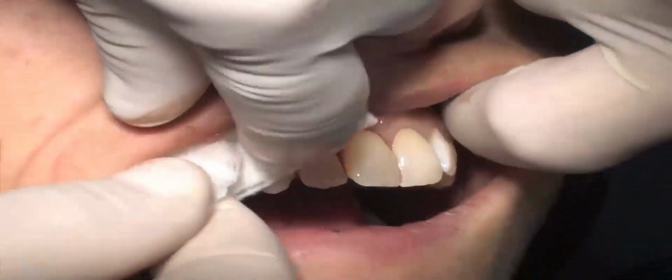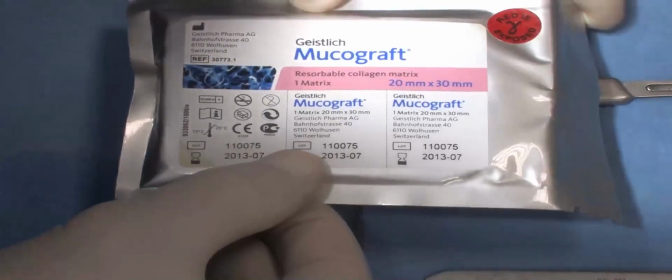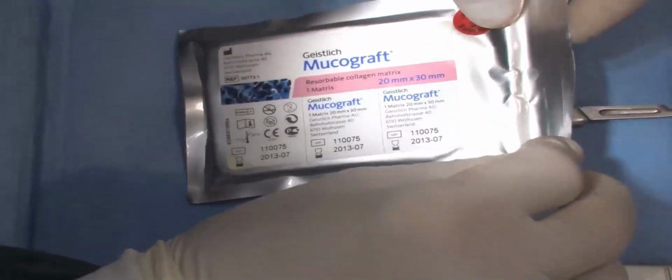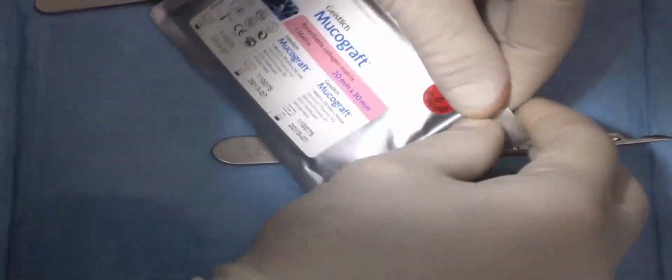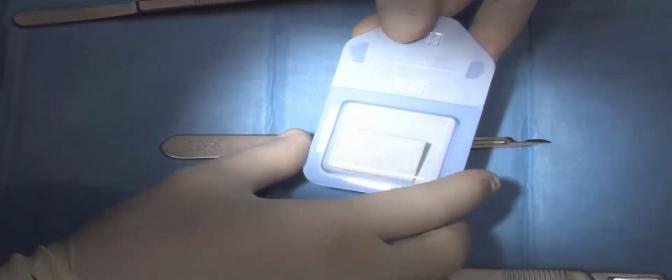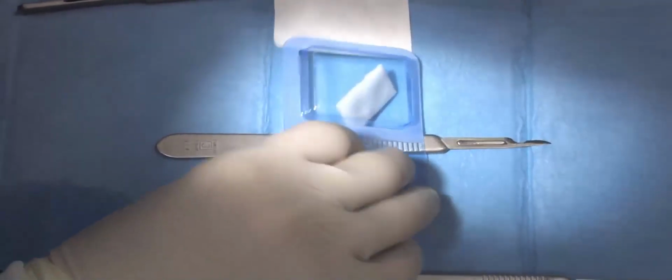Mouth of the patient during the preparation of the mucograft. It's single packaging. And this is how the material is presented once it has been opened. We placed on our table.